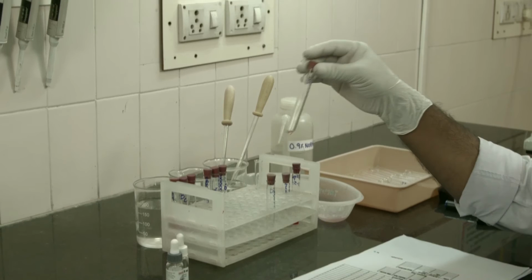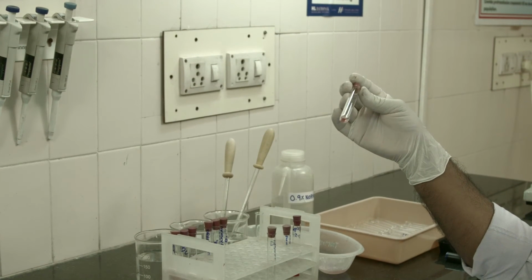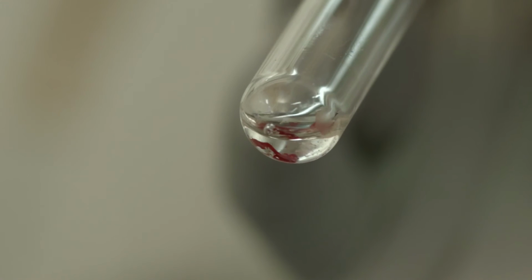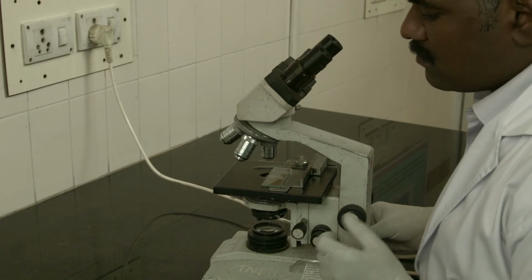Examine for hemolysis or agglutination after gently resuspending the red cell button. Record and interpret the results immediately. Confirm the negative results with a microscope.